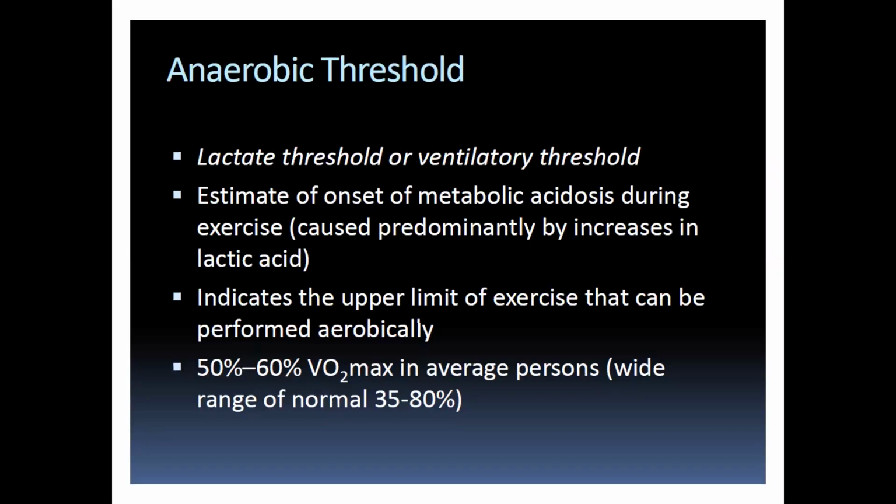Now, anaerobic threshold is a very important number that you should be able to pick up where it occurs, because normal people will develop an anaerobic threshold, also known as ventilatory threshold. Some people also call it the lactate threshold, at around the halfway point for their peak VO2, or around one half to 2/3 of the way into their exercise. They will hit this ventilatory anaerobic threshold, okay?